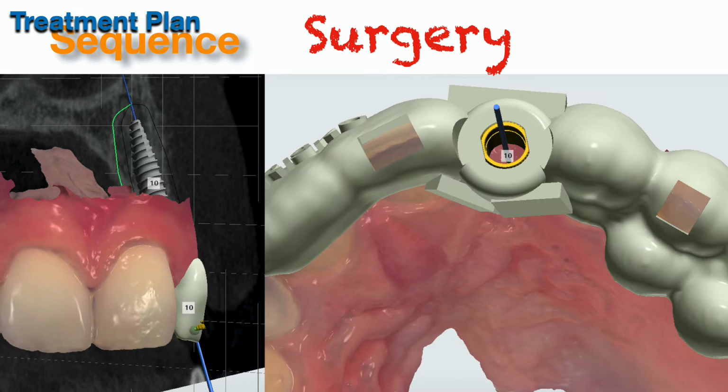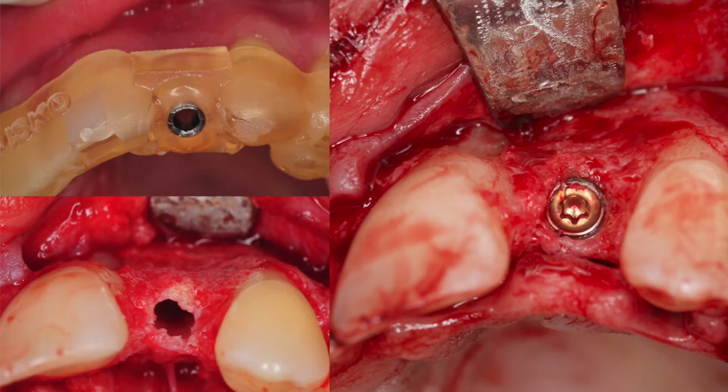We'll go ahead and do the plan, our surgical guide in place. We'll place the implant using the guided technique. That's a great picture. So there's absolutely adequate bone for implant placement. But long term, 5, 10, 15 years, is there adequate bone long term? Can we keep that bone long term?